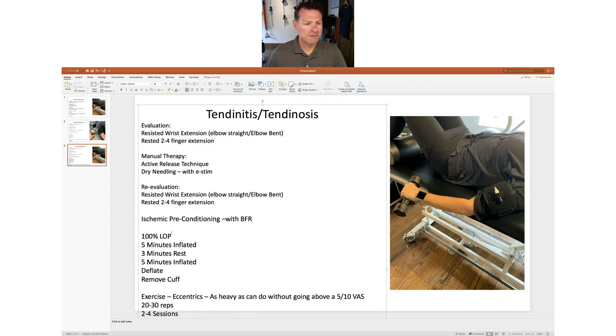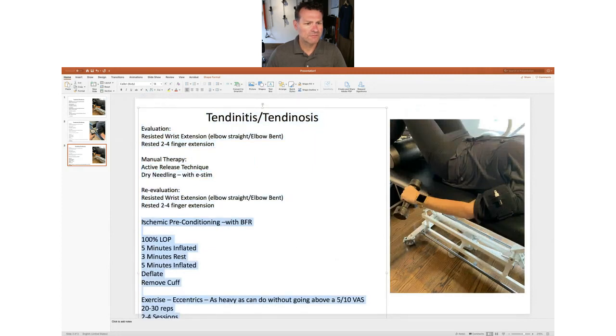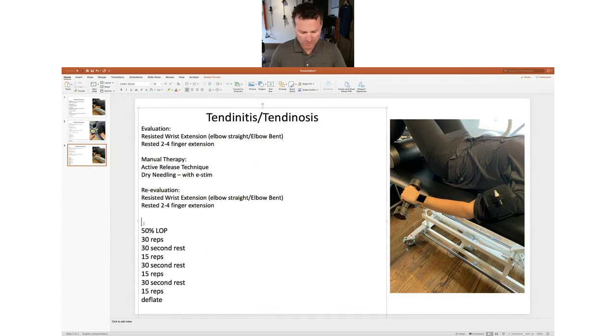And now I'm going to do just my normal, this would just be normal strengthening, hypertrophy. 50% limb occlusion pressure, 30 reps, 30-second rest, 15 reps, 30-second rest, 15 reps, 30-second rest, 15 reps, deflate. And that's going to be it for that. That's all you're going to need for that exercise. You're going to fatigue everything out there, and depending on severity, usually I can get this done in about 4 to 6 visits.